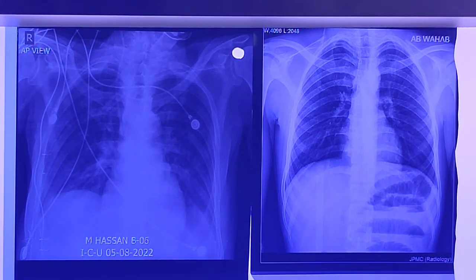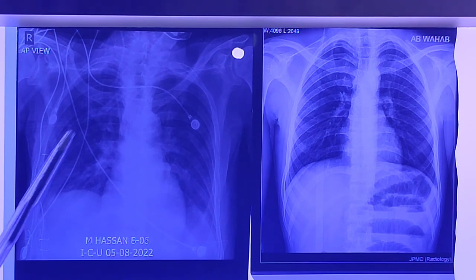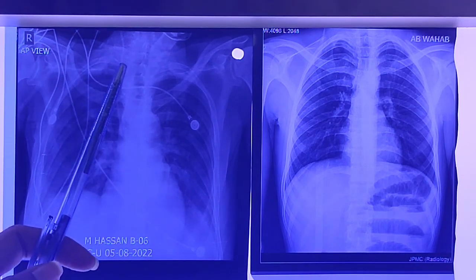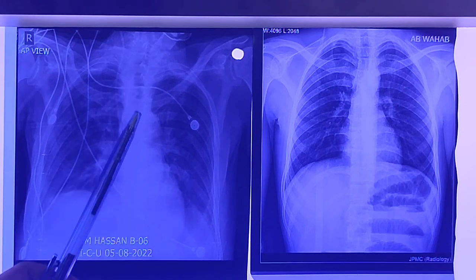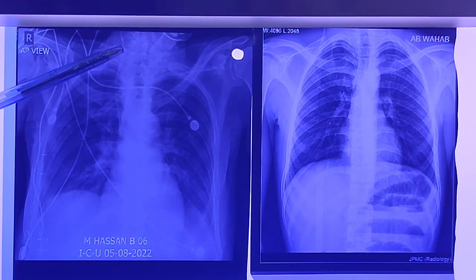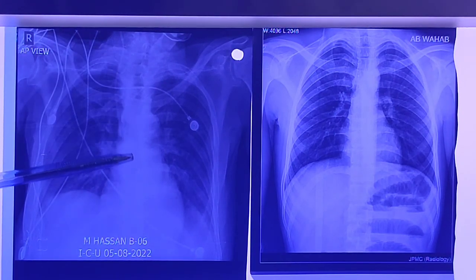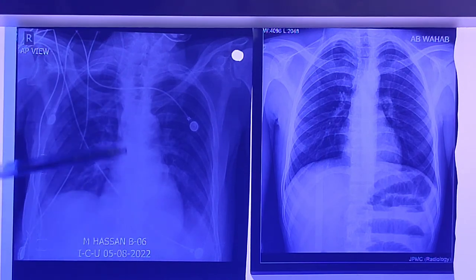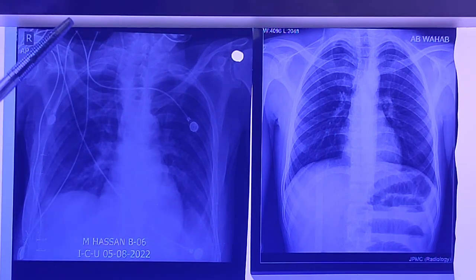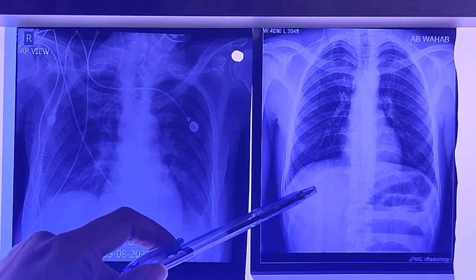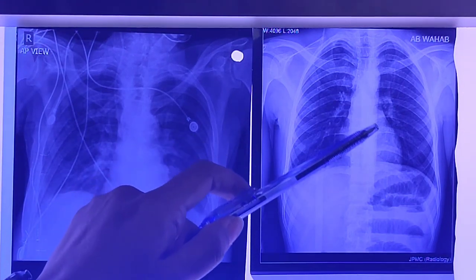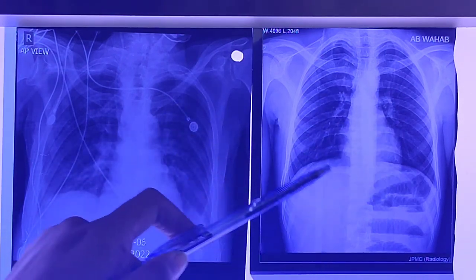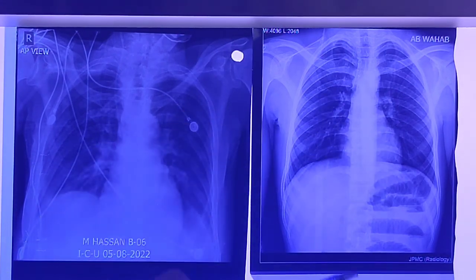The next differentiating point is the thoracic vertebra. In the AP view you can clearly see the thoracic vertebra — it is seen prominently through the heart shadow. While in the PA view the thoracic vertebra cannot be seen from the angle of the shadow of the heart.